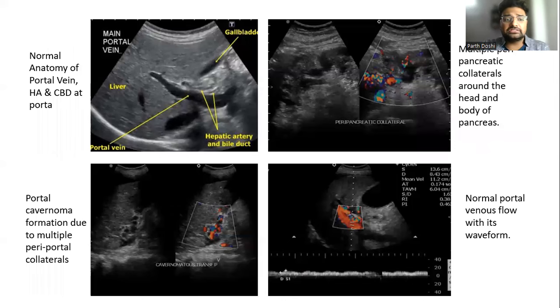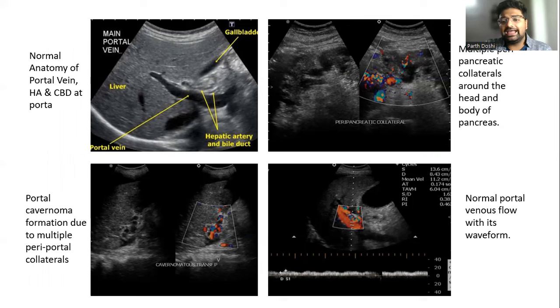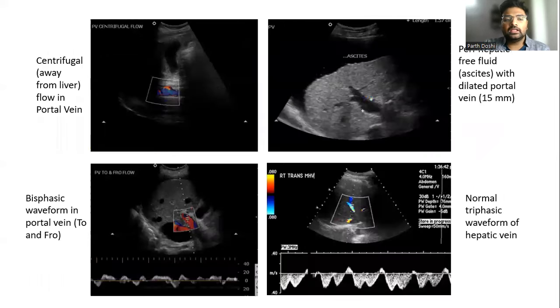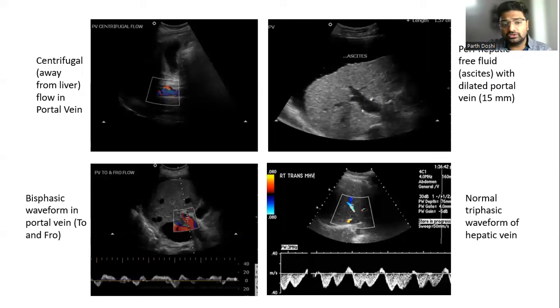These ultrasound images show the normal anatomy at the porta, certain peripancreatic collaterals, cavernomatous transformation of the portal vein due to multiple collaterals, and a normal portal venous flow with its waveform. Additional images show the centrifugal flow pattern in the portal vein along with ascites and a dilated portal vein, a biphasic waveform in the portal vein which is the to-and-fro flow pattern, and the normal triphasic waveform of the hepatic vein.